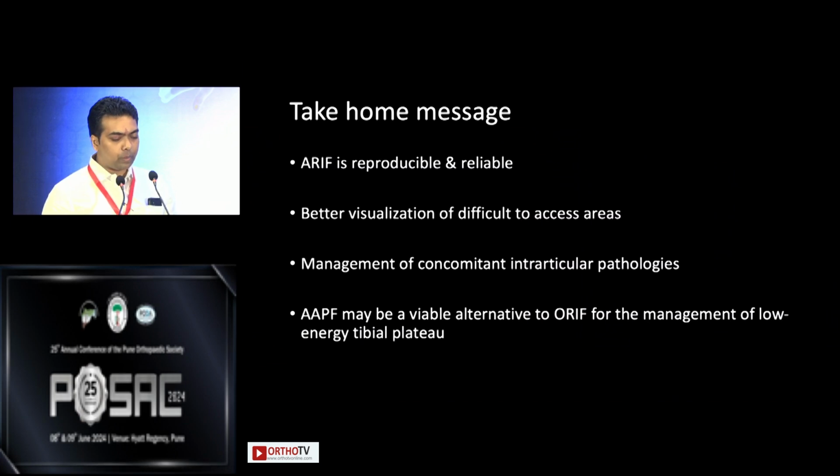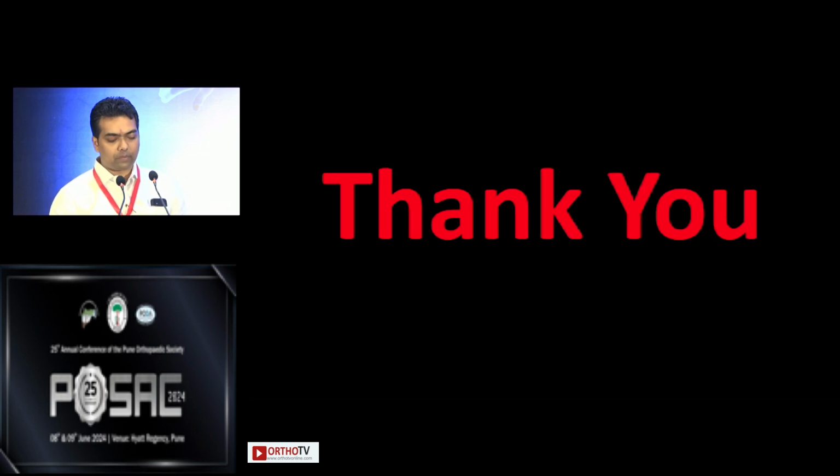So arthroscopic-assisted fixation is reproducible and reliable. It allows us better visualization in difficult access areas, and it allows us to manage concomitant intra-articular pathologies. But I think it should still be reserved for simple cases of simple splits and depressions and not for very complicated proximal tibia fractures.